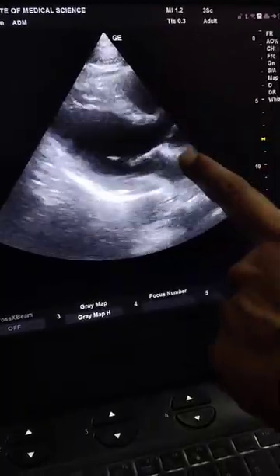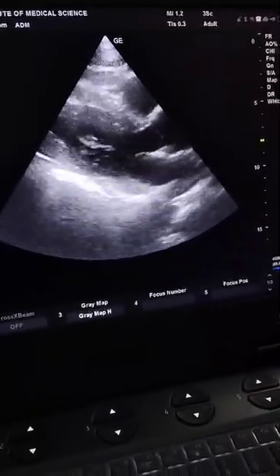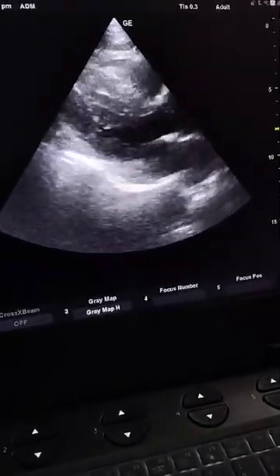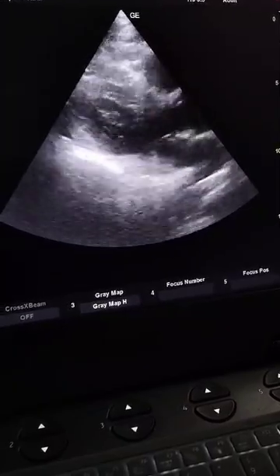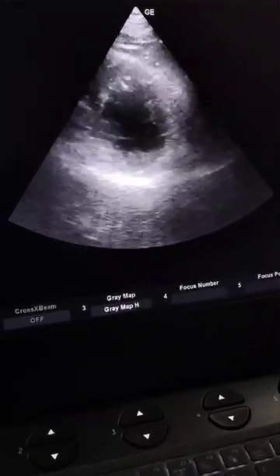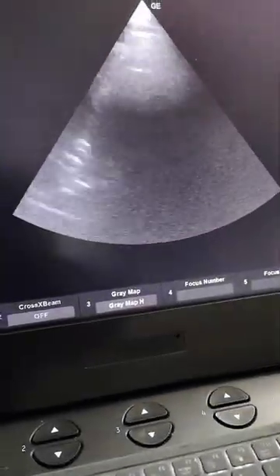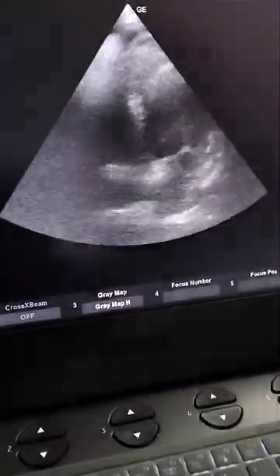Now if you see the aortic root here and the LA here, and you compare it with the LA and the aortic root of just the previous echo of the 20-year-old boy, there the LA was slightly bigger, and this LA is almost the same size as the aortic root, which is normal. So the LA is still okay, meaning there hasn't been enough LV-EDP to increase the size, but the LV hypertrophy is kind of suggestive that his shortness of breath could be related to an early heart failure with preserved ejection fraction. Ejection fraction is preserved, as you can see, so it's quite okay. It's around 60%. In fact, he has gotten it done elsewhere, either he or somebody else, I can't remember.